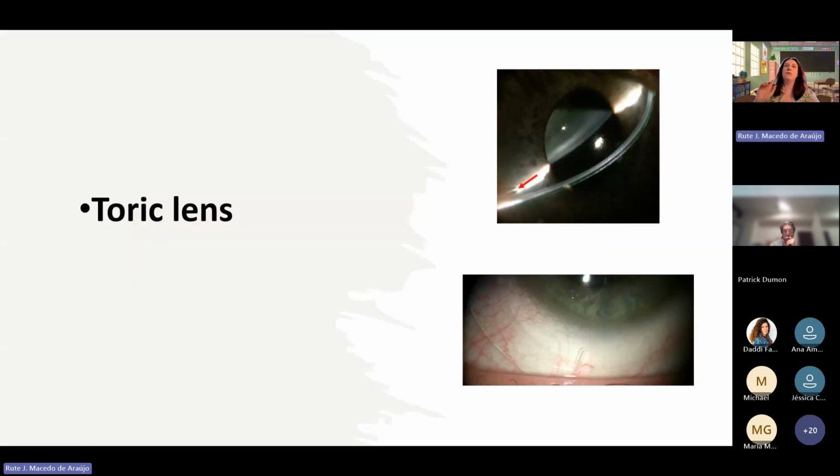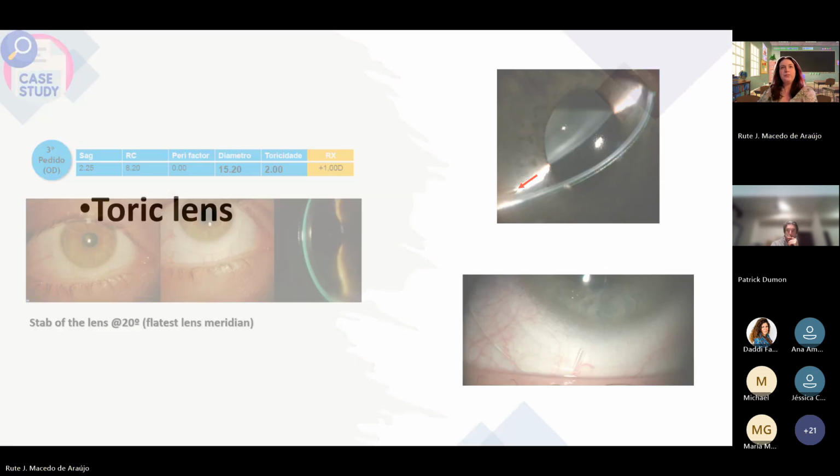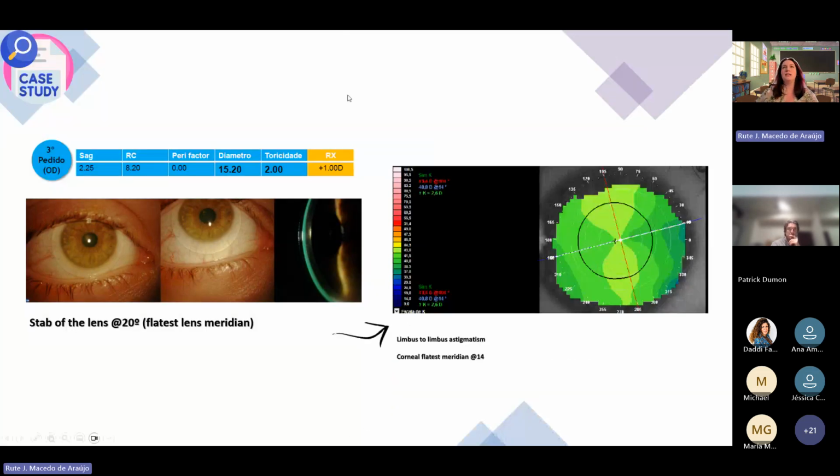And remember that when we have a toric lens, there are these marks that, in most manufacturers, say where the flattest meridian of the scleral lens is. And if you have a toric over refraction, you need to tell the manufacturer where the flattest meridian of the lens is. And why am I telling you this? Because this is an interesting thing. In this patient, the stabilization of the lens, so the flattest lens meridian, was at 20 degrees.